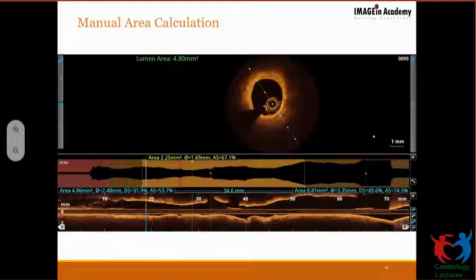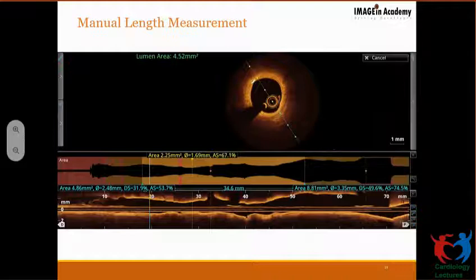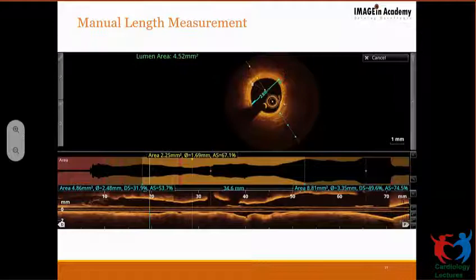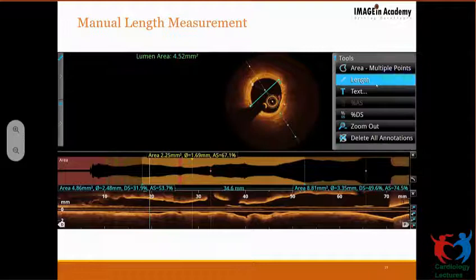Now the other thing which I can do is, again, I select length, and when I select the length, if I'm able to identify the EEL, I'll measure the EEL. So what you get is the system measured dimension, which is essentially lumen based. And as you can see, the two dimensions, 2.94 and 2.8, which I've got now, are slightly more than the lumen based measurement.